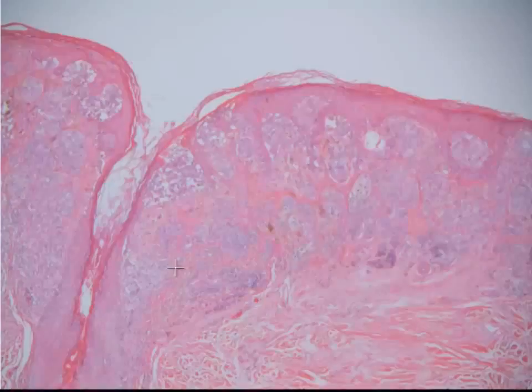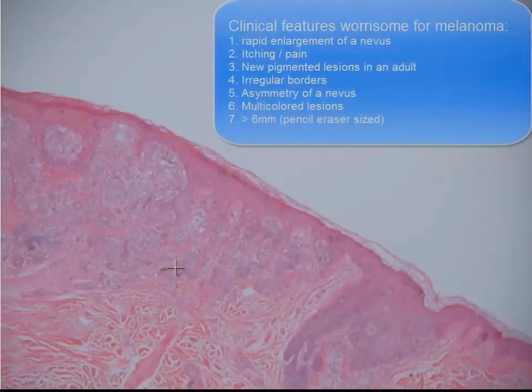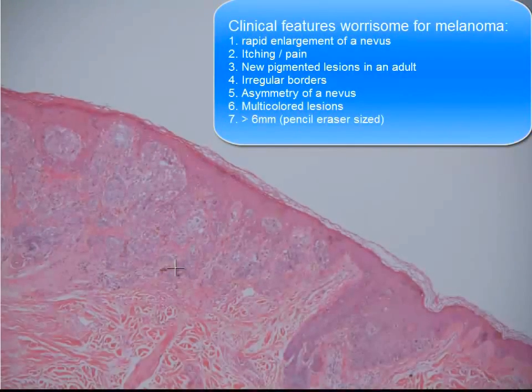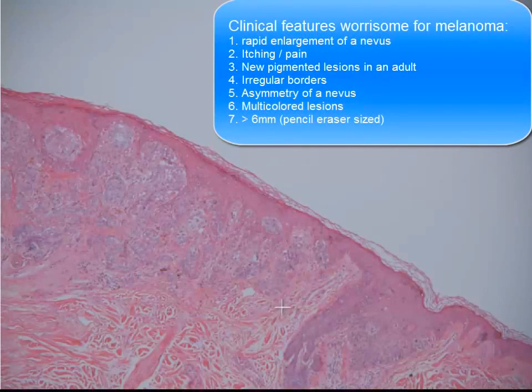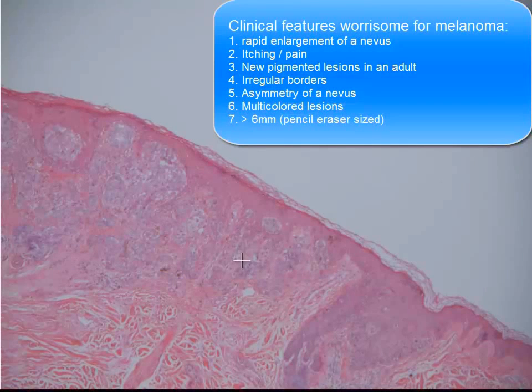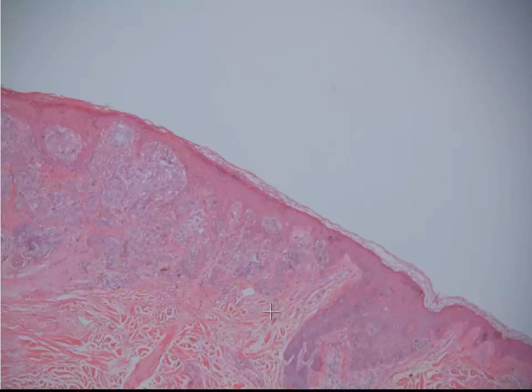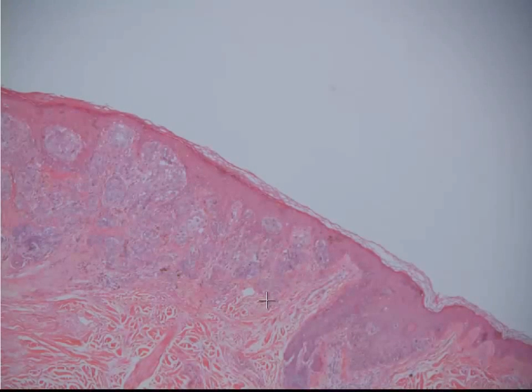Other features that help with that distinction: these lesions have very irregular borders and are not symmetrical. There might also be some dermal mitoses seen in these melanocytes — in this case, if you search for them, you might find one or two, though often you don't find that many. In summary, what we have is a spectrum of melanocytic lesions ranging from a nevus all the way up to an invasive melanoma.